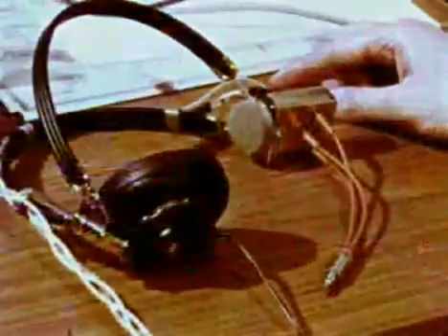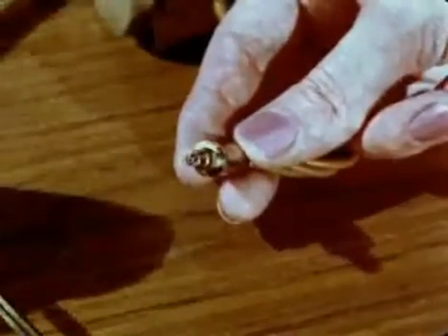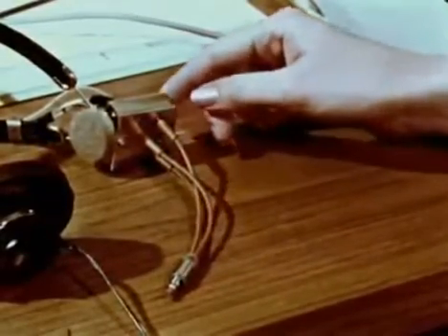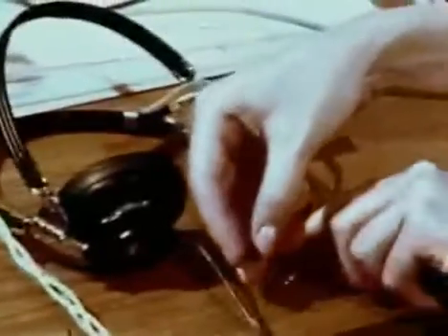One of the essential practical features of the equipment is the probe, which fits into the external canal with an airtight seal. It has 3 holes, to which are fitted rubber tubes connected to the sound source, the probe microphone, and the air pump. A variety of rubber tips are available for the ear probe to ensure a comfortable, airtight seal.